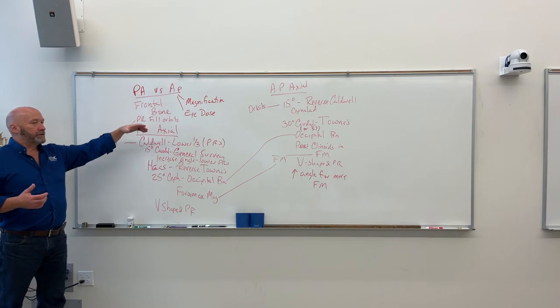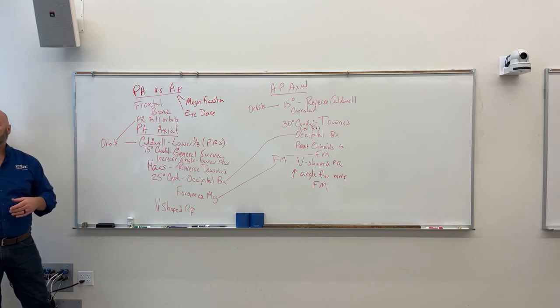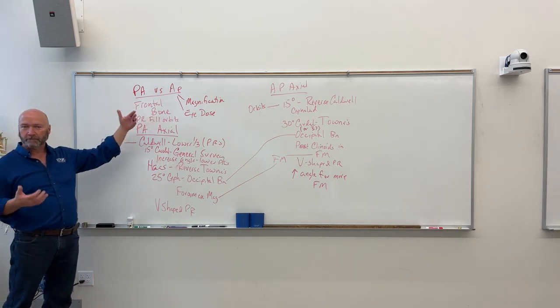So the reason the eyes look the way they do is because the petrous ridges are completely filling the orbits. And some of your test questions may say the petrous ridges are at the top of the orbits. What that's referring to is the top of the petrous ridge at the top of the orbit, which means you fill the orbit, right? So it really means the same thing.